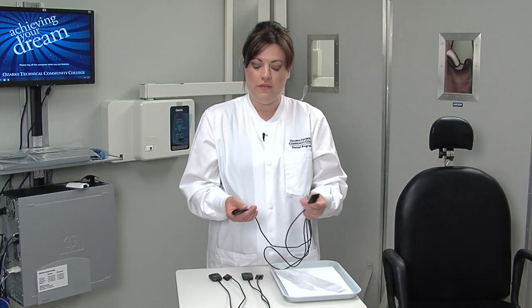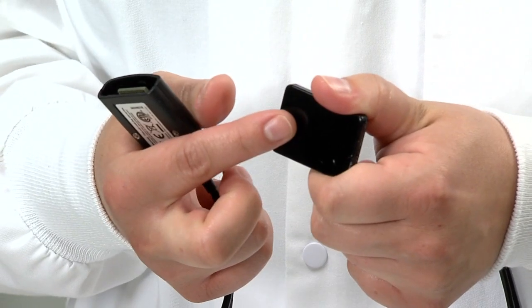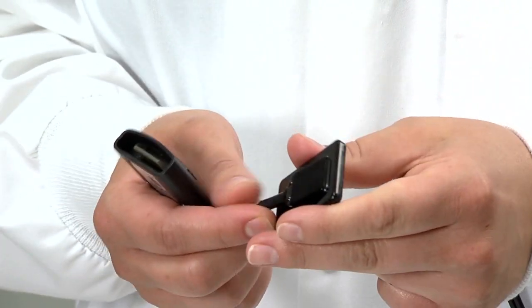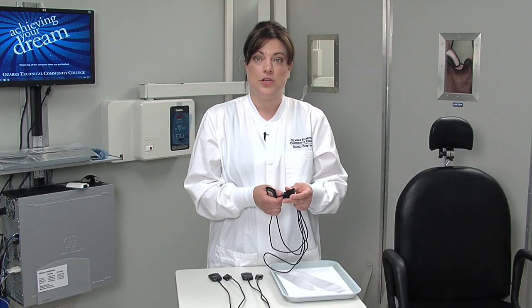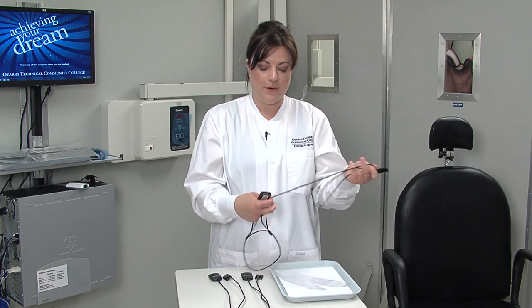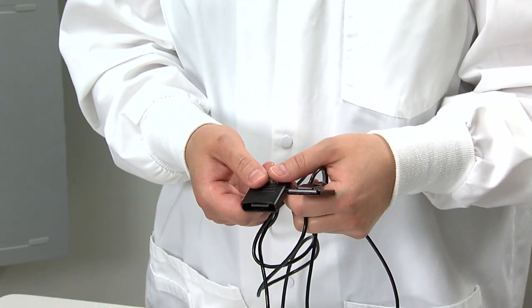The sensor itself has 3 basic parts. The top of it is the actual sensor with the flat side that is placed towards the source of radiation. The back side of the sensor is where the cable plugs in. So this is how you determine the front or back of the sensor, just as you would determine the front or back of your intraoral film. The cable, the long portion, then connects to this piece that will be plugged into a remote on the computer.